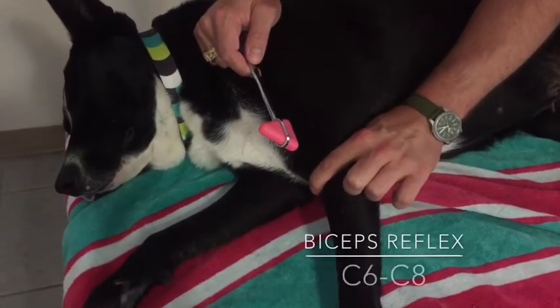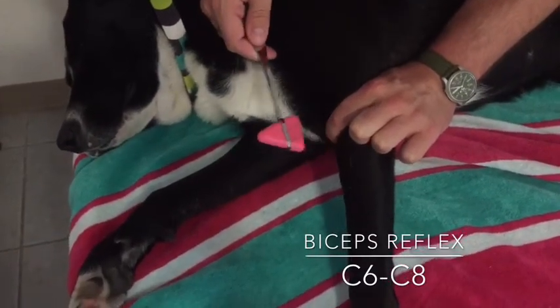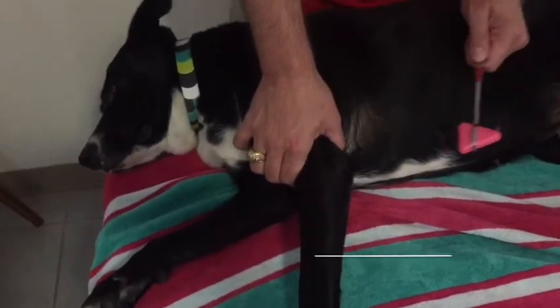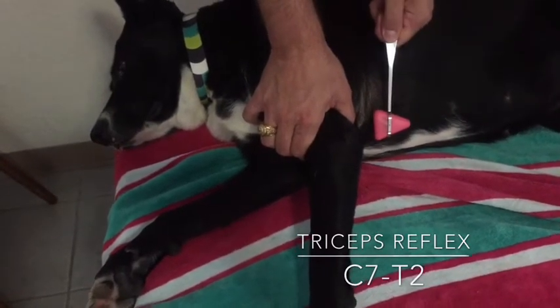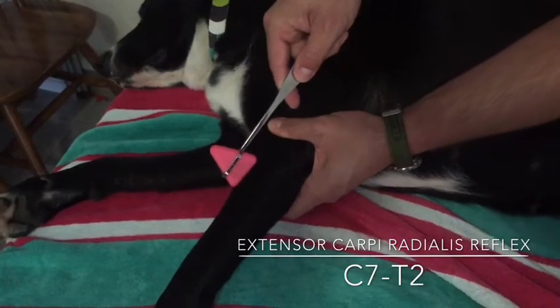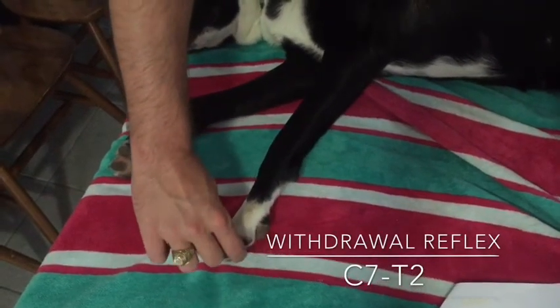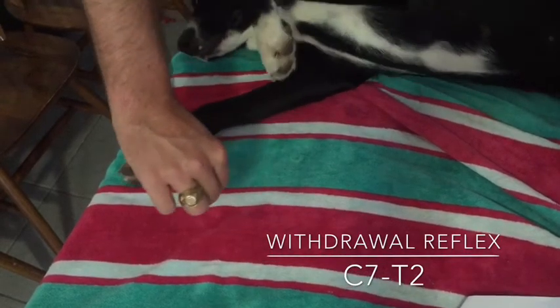Place a finger on the biceps tendon and percuss the finger; a brief elbow flexion indicates a normal reflex. Place a finger on the triceps tendon and percuss the finger; a brief elbow extension indicates a normal reflex. Directly percuss the extensor carpi radialis muscle; a brief extension of the carpus indicates a normal muscle response. Pinch the toe with fingers or forceps; flexion of the limb joints indicates a normal withdrawal reflex. Pain is present if the animal cries or growls.